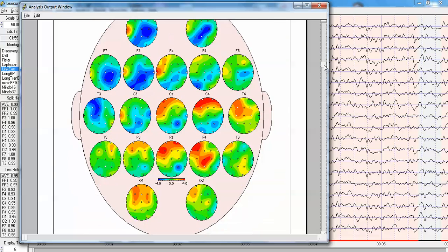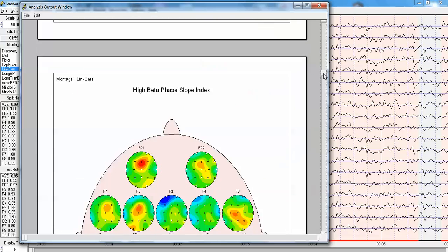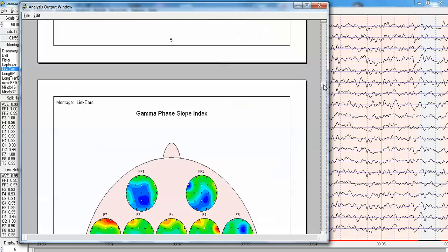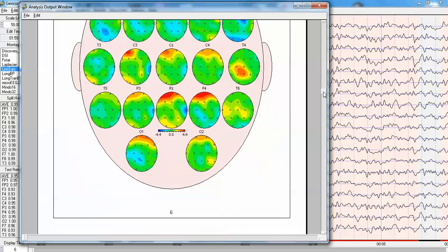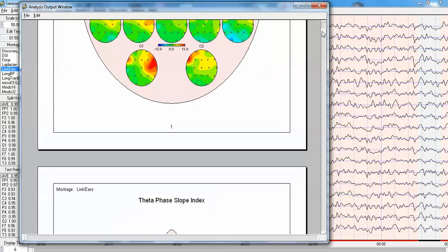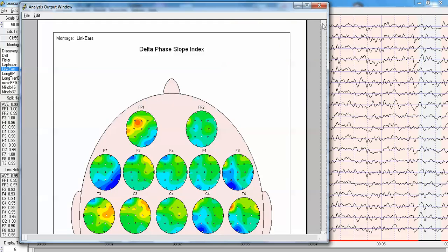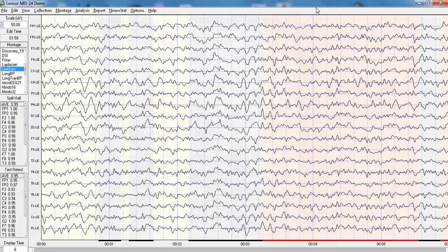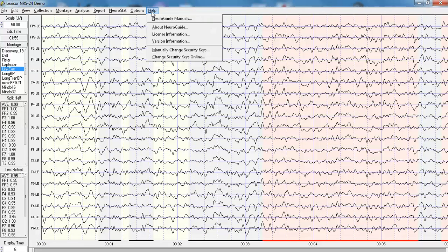And similarly, information flow can be seen in these other frequency bands. Now, I want to show how I produce this inside of NeuroGuide. First, we have the demo, which you can get to by clicking Help, Enter Demo Mode.